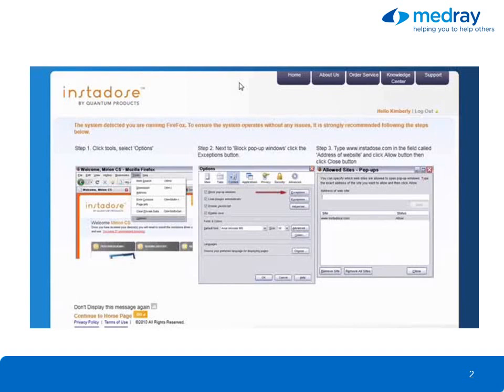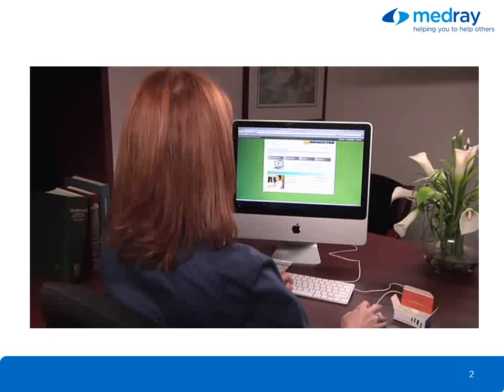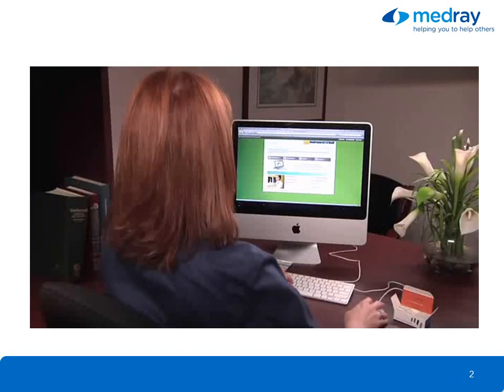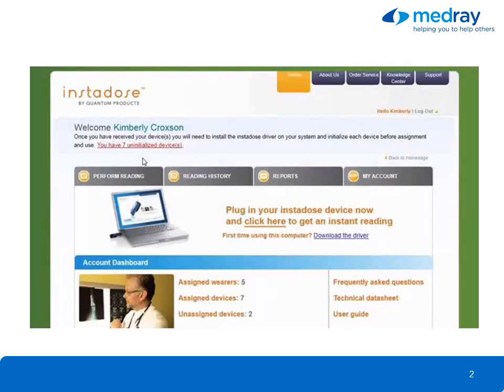Once you've completed the steps, click Go to be directed to your homepage. From your homepage, you'll need to install the InstaDose driver on your system and initialize each device before assignment and use.